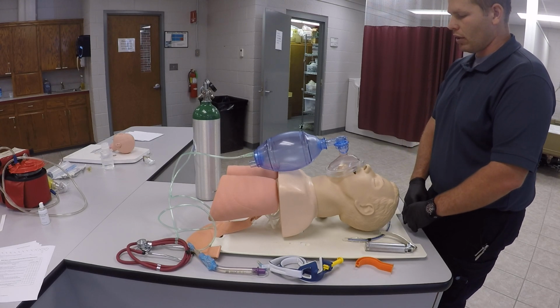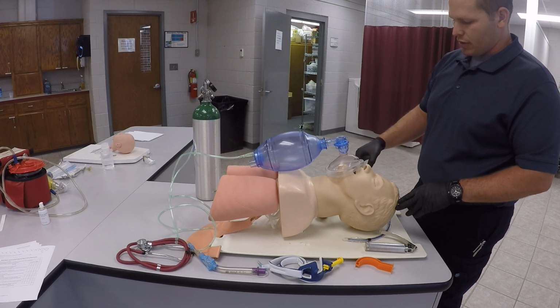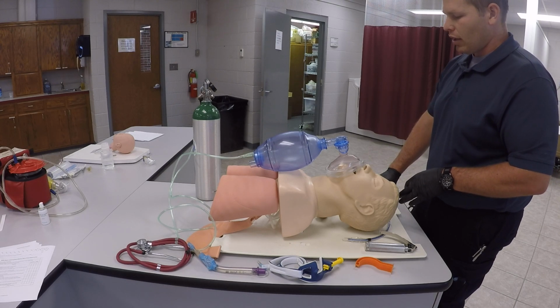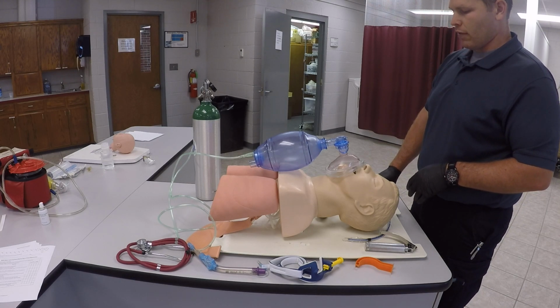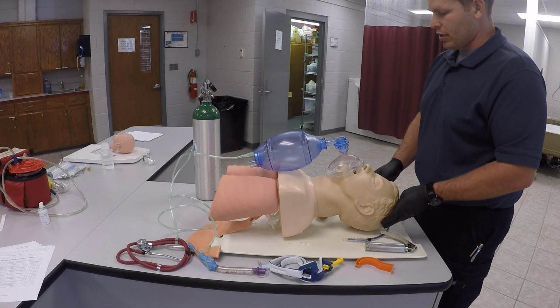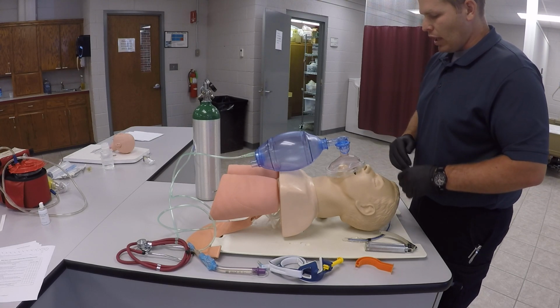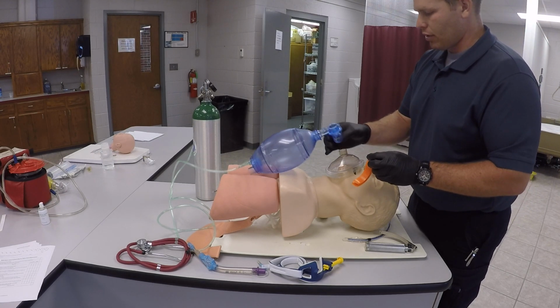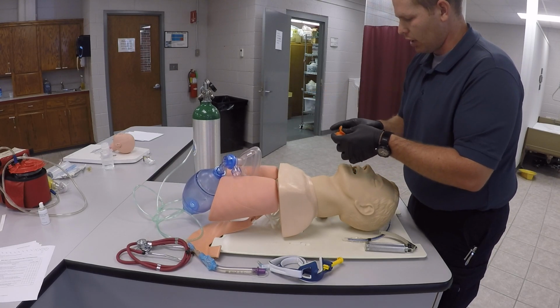All right, once we've drawn up our medications, we're going to give our sedative first, our etomidate, and give that IV, and then after that we're going to give it about 30 to 60 seconds and then give our paralytic, which would be our succinylcholine. Then once those have taken effect, our patient will become easier to bag, and then we're going to make sure we have the appropriately sized airway here and insert the airway and get that bag out of the way.